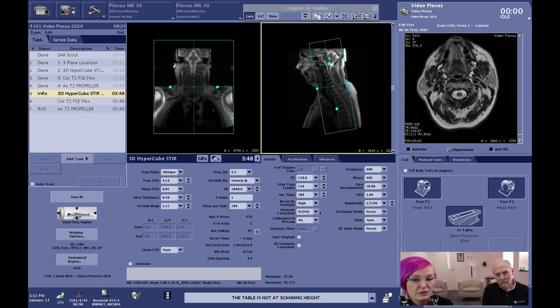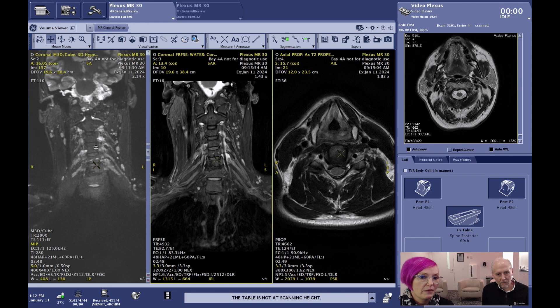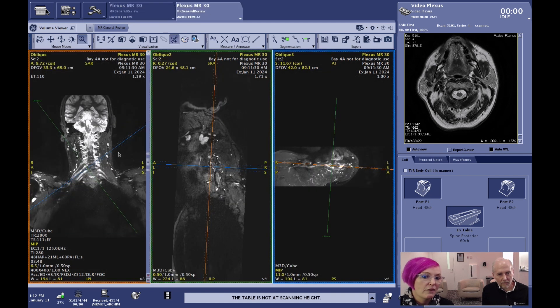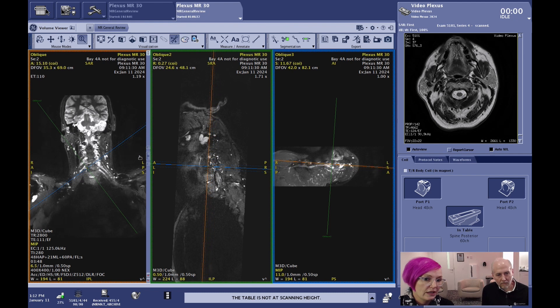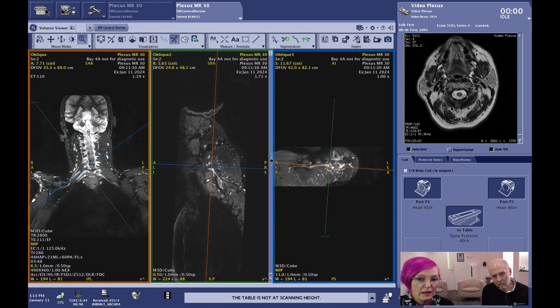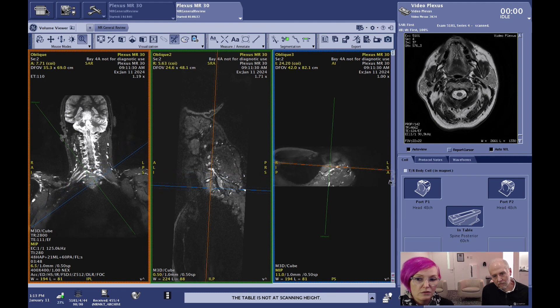We also applied AIR Recon DL, as you can see here in the sequence. The acquired pixel size for that scan is 1x1x1 isotropic, and as you can see, we covered a really great volume. When we look at the images, we have a first overview here with the STIR, and then we did some reformats. Since it was a 3D volume with isotropic pixels, you can go double oblique — following the nerve from its start all the way down to the arm. You have all three views available: a short axis and a long axis, so you can really see the nerve displayed in full length.